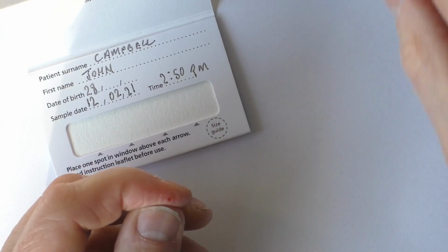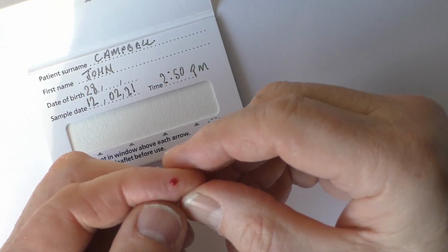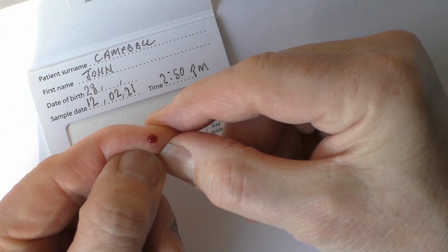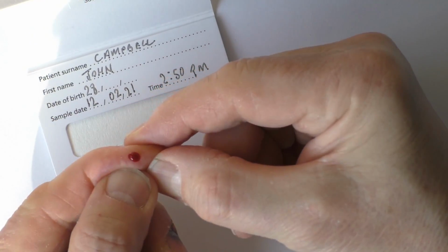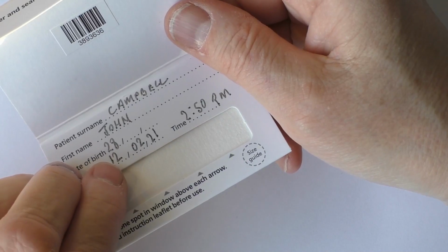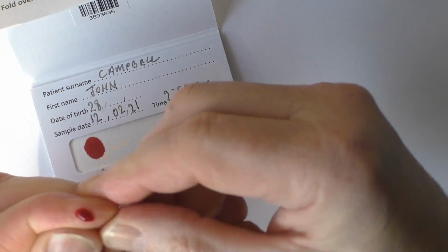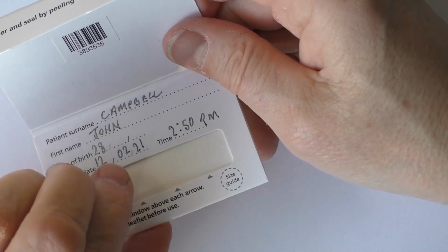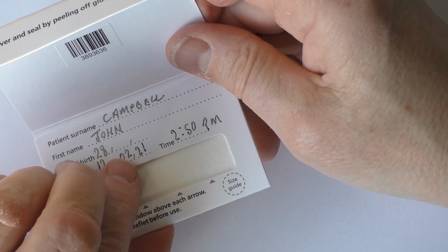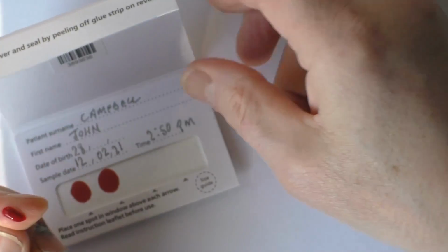There we go. And the first blood you should wipe away like that. Then we give a bit of a squeeze. Hopefully you can see the blood coming there. And we put that on the first spot. We don't touch, we just drop it on like that. There we go. And we squeeze some more. It's amazing how much blood you can milk out of one of these little pricks if you give it a bit of a squeeze. There we go.